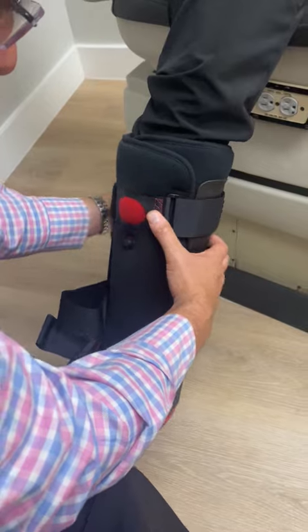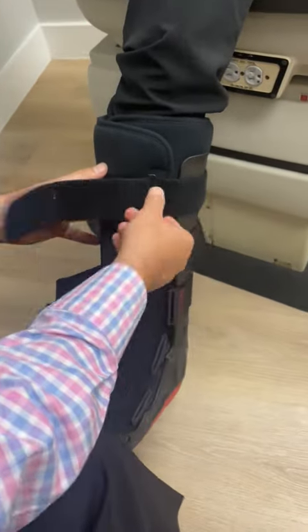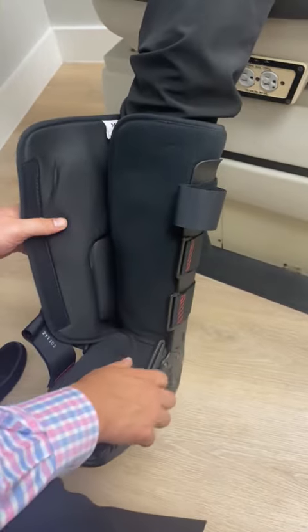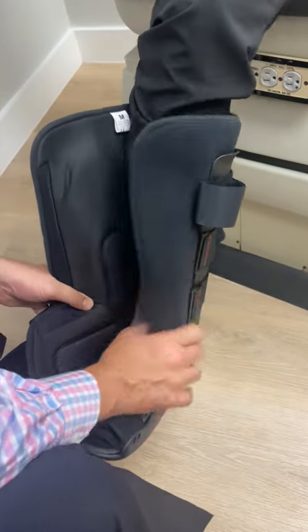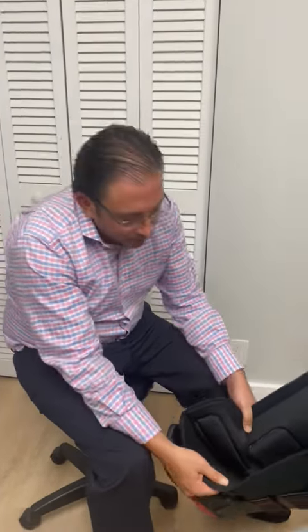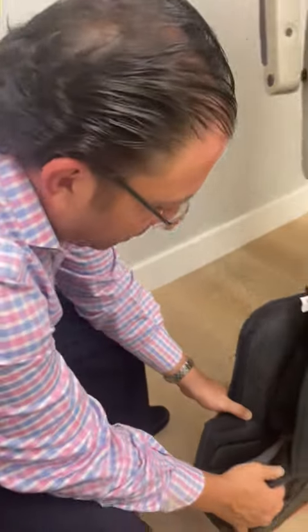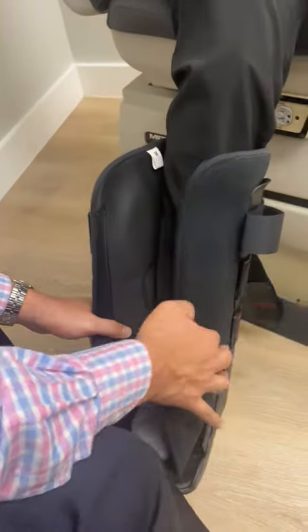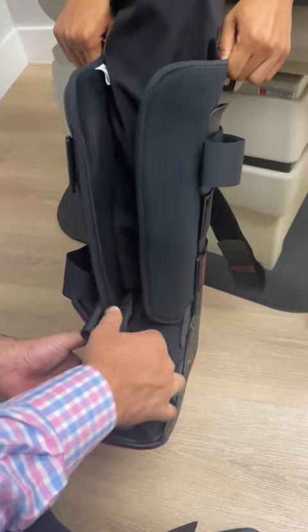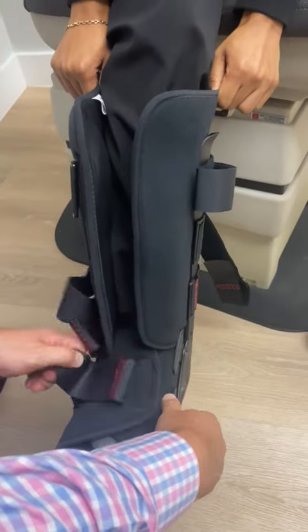To finish the strapping, you go like that, and you open it up — open it up — and you can take your foot out like that. Now to put it back, place your foot in. It's sometimes easier to do on the ground so you can make sure your foot's all the way on the bottom.